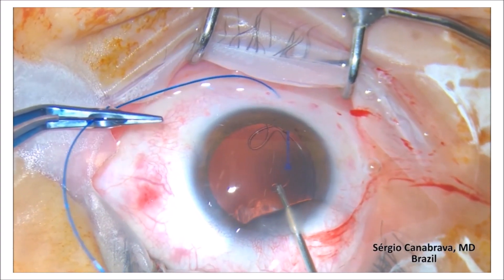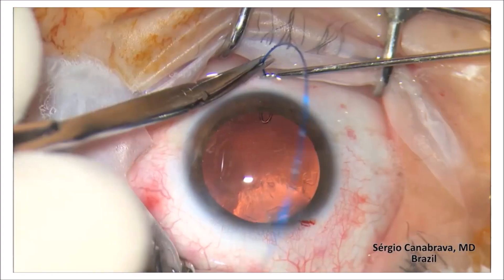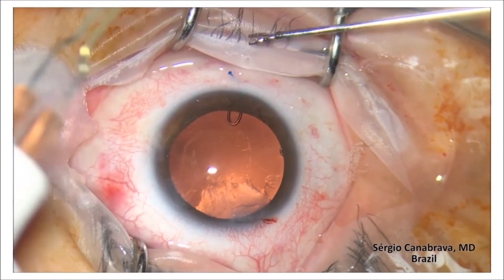Today I will discuss about the five years of the Karna Bravas polypropylene double flange technique and 10 tips for this technique. In 2017 I presented it for the first time in Los Angeles at the ASIS Film Festival and received a first prize for this technique. I kept my studies, and you can see this video — it was the first video I presented with the polypropylene, a simple polypropylene that was forgotten in ophthalmology.